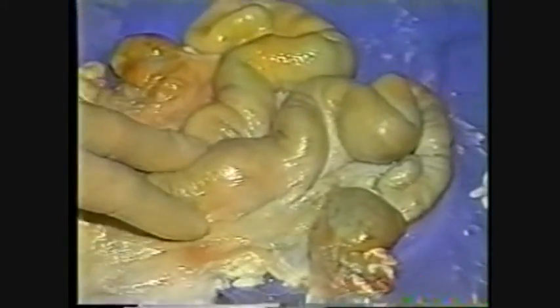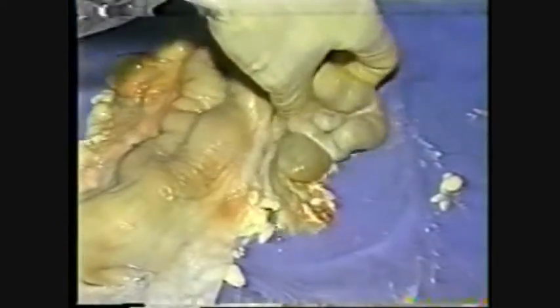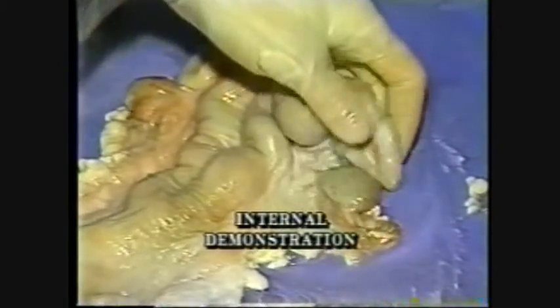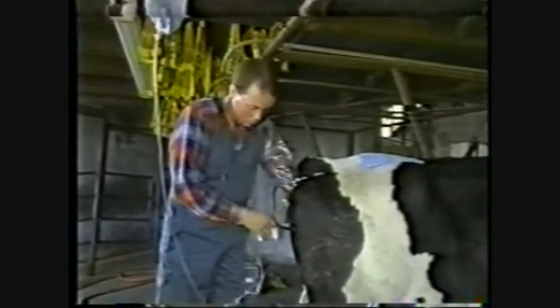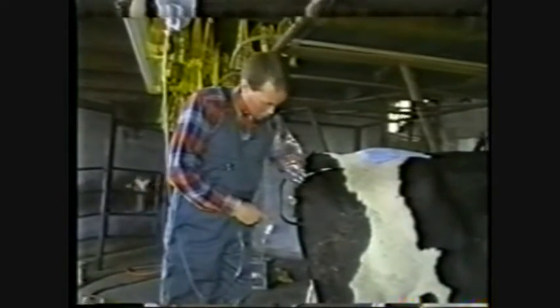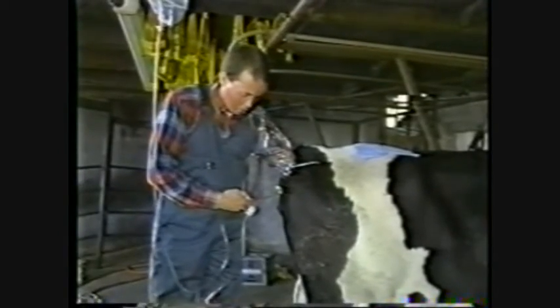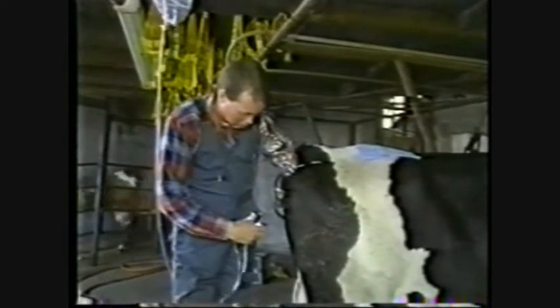And again, before you let any fluid into the animal, you're going to feel ahead, palpate down, locate the entire horn. Ideally, you want the upper one-third of the horn in your grasp, in your control, before you start to fill. I feel comfortable with this. Now look for fluid. We'll show you how it fills.